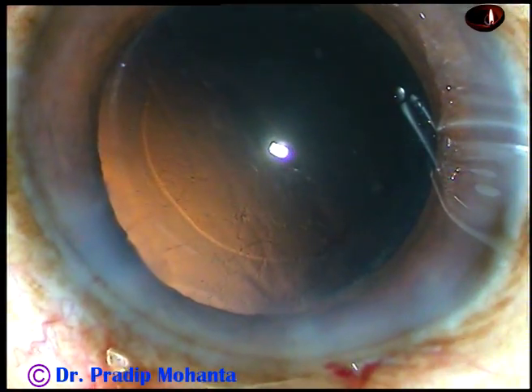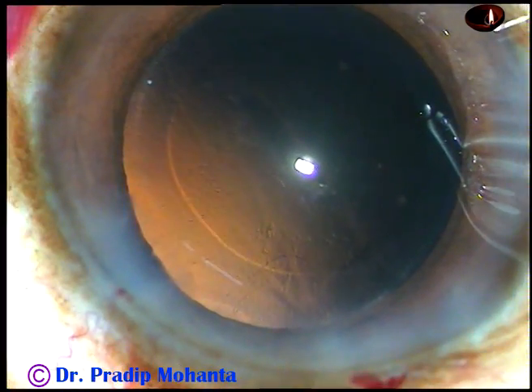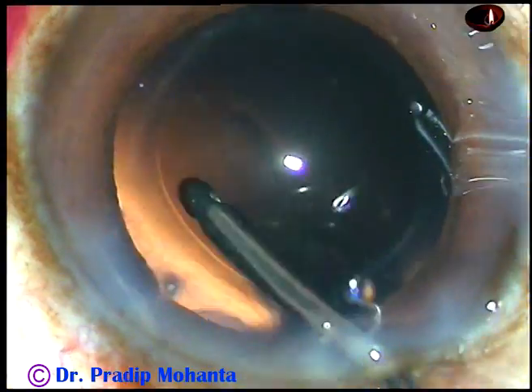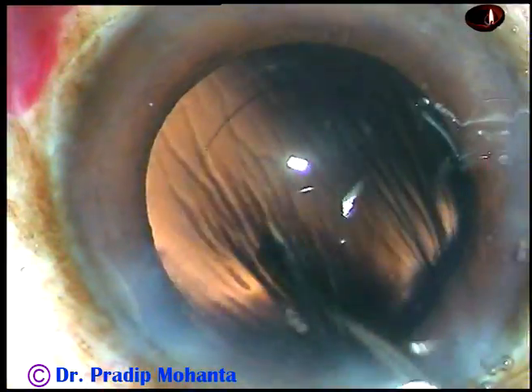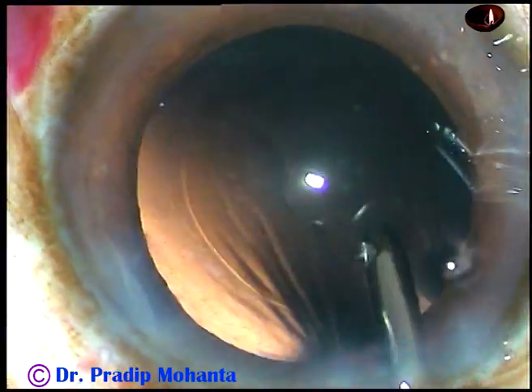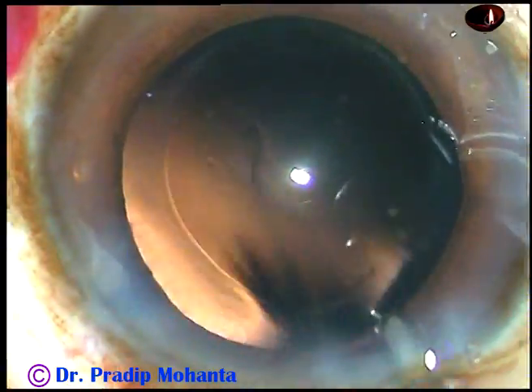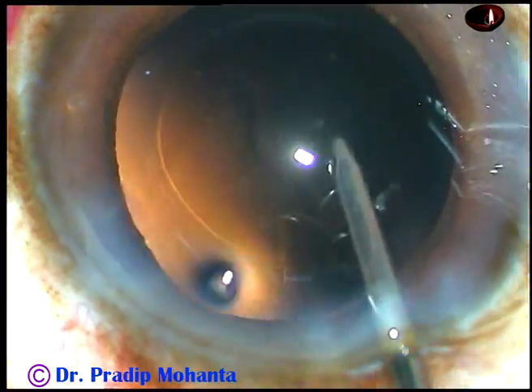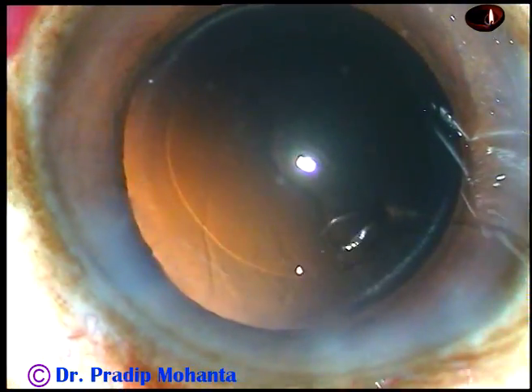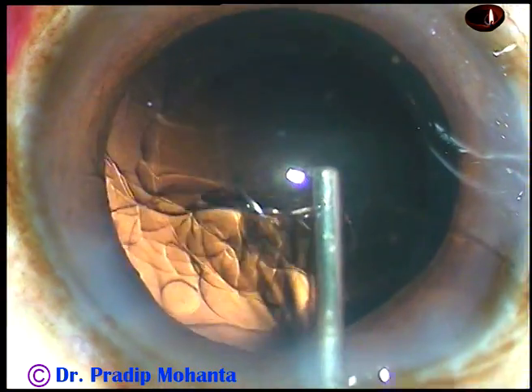There are some cells sticking to the posterior capsule, and the posterior capsule needs a little bit of polishing. This is what I call hydropolish — using a jet of balanced salt solution to dislodge the cells from the posterior capsule. See how beautifully the posterior capsule has been polished.